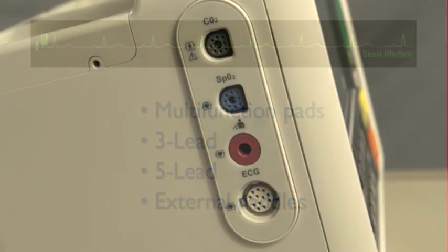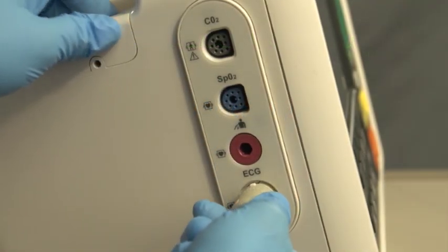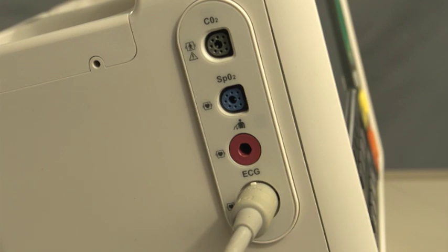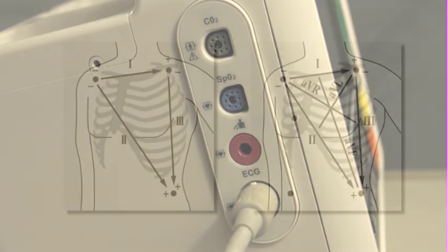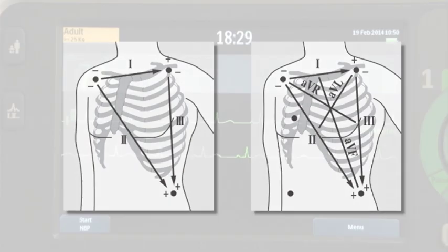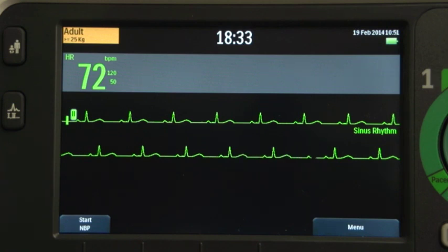The ECG cable is color-coded and keyed to fit the white ECG port. For proper lead placement in three and five lead sets, consult the instructions for use. The monitoring leads available depend on what type of ECG cable is connected to the DFM100.